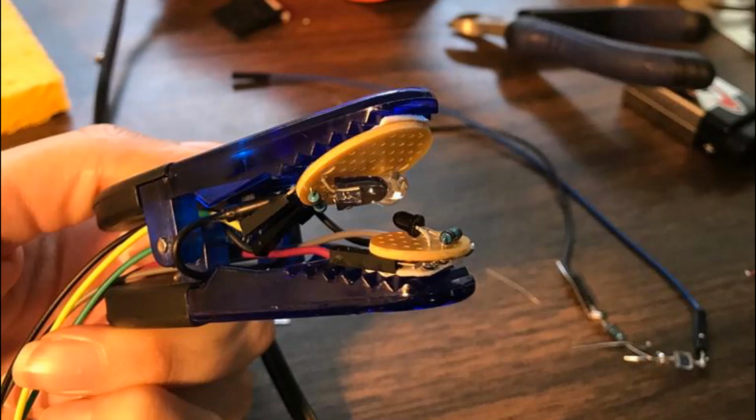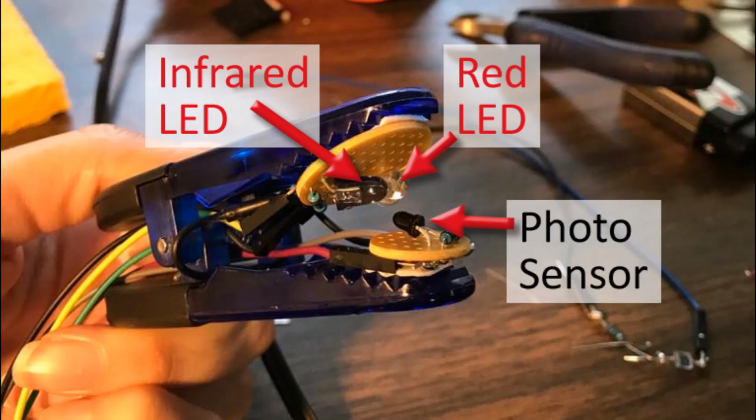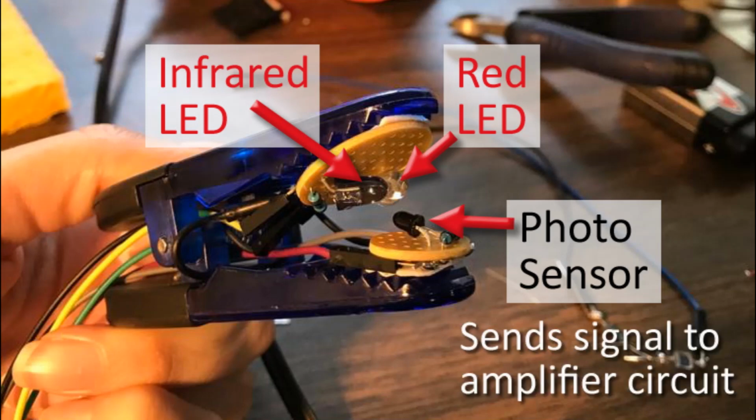Here is a picture of the finger clip of our pulse oximeter. It has a red LED and infrared LED on the top and a photosensor or phototransistor on the bottom of the clip. The LEDs shine light through the consumer's finger and is detected by the sensor. Then, the sensor's data is sent to the amplifier circuit of our pulse oximeter.